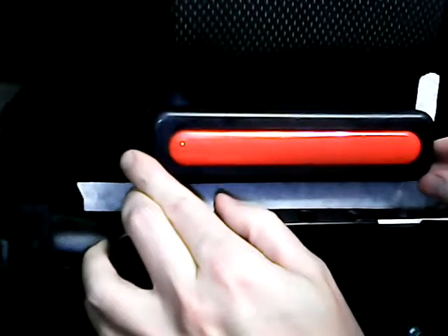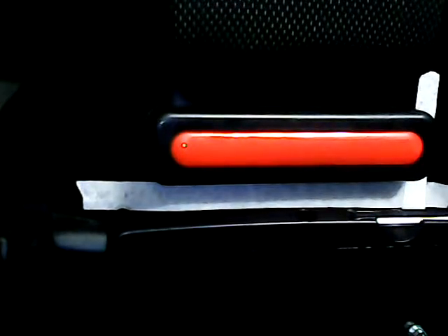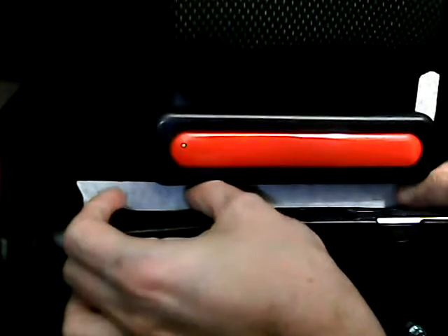So with the PL 9000, you have approximately 15 minutes to go ahead and reposition. And then once you're outside of that time, it's there. And I was well assured at the hardware store where I bought this that it's not going anywhere. And it would actually cause damage to rip apart and destroy the item it was glued to. Okay, I'm just taking one final look underneath to make sure it lines up with the tape guide that I'd put on for myself, and it's looking real good. So I'm going to leave it there.